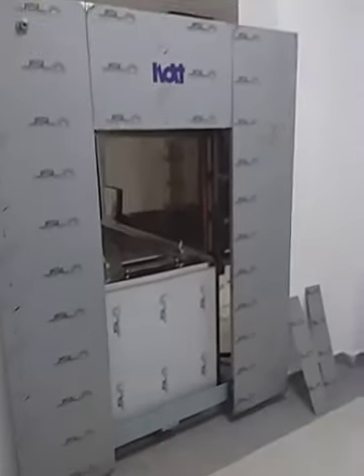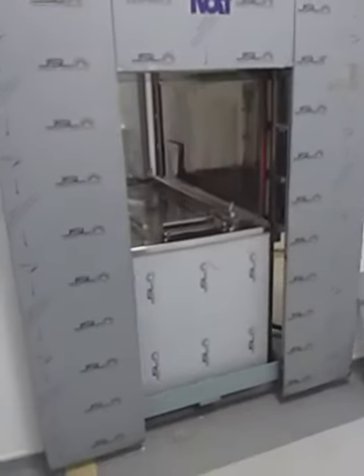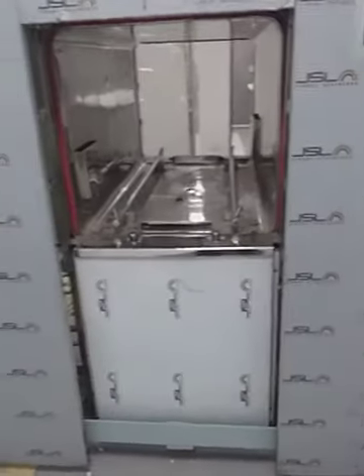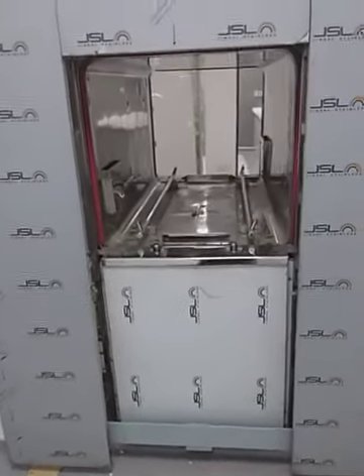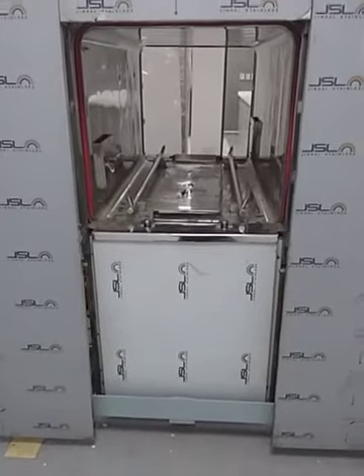If you want to know for what purpose this machine is used, you can watch my video further. This machine is used in the hospital — specifically in the operation theater to disinfect the load. Because in the operation theater we do surgery, and the infection should not pass from one person to another person.